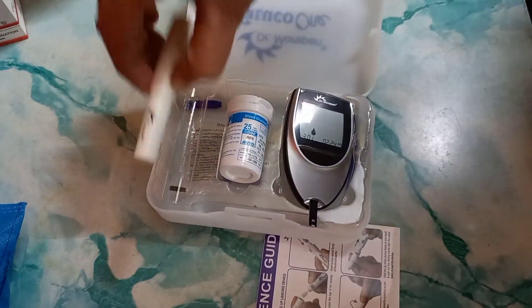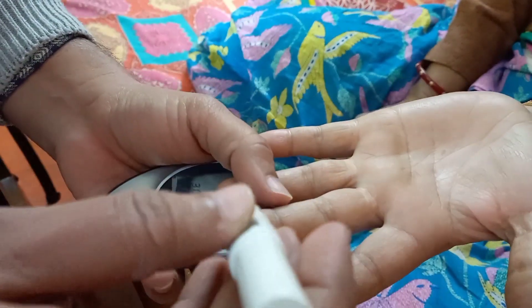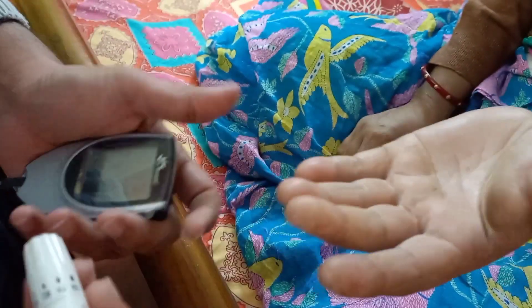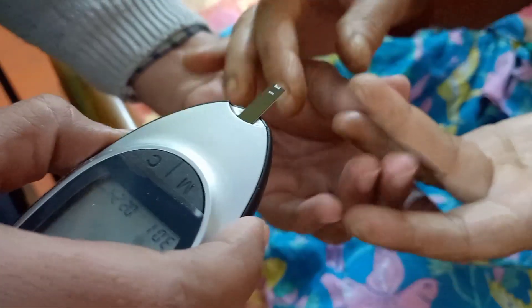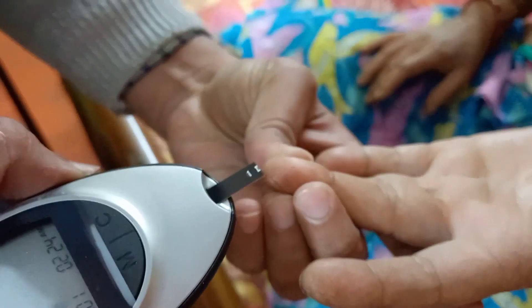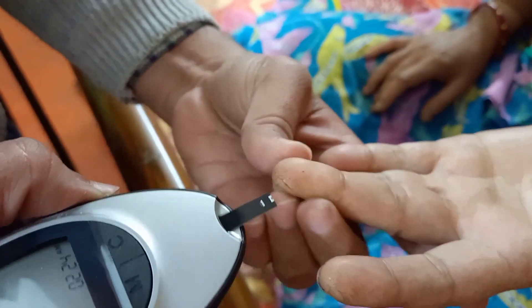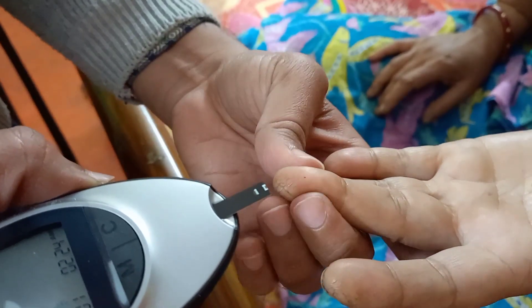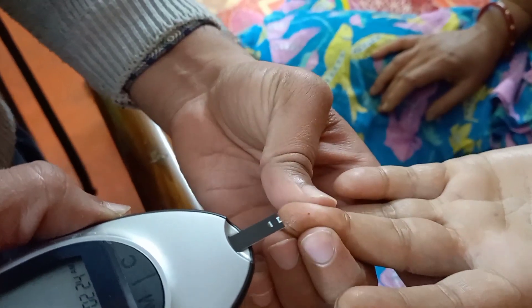Now take the lancing device, place it on the finger and press the button of the lancing device. Now press the finger to take blood. Press a little bit to obtain blood from the finger. Blood is coming from the finger.